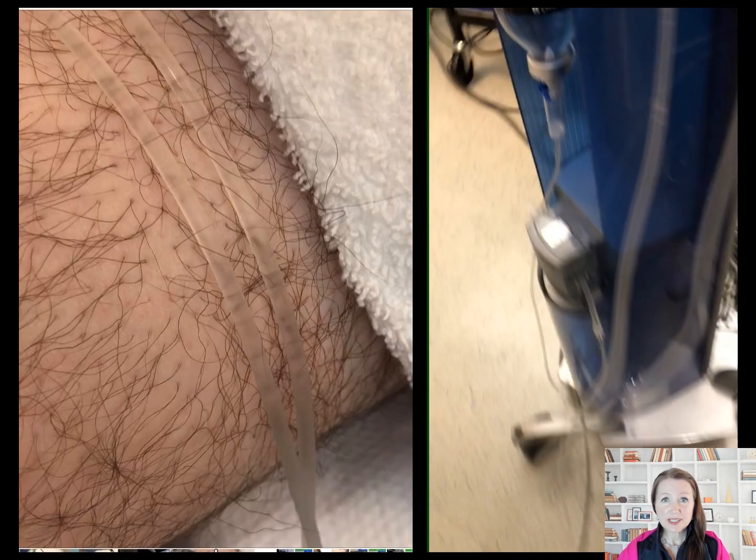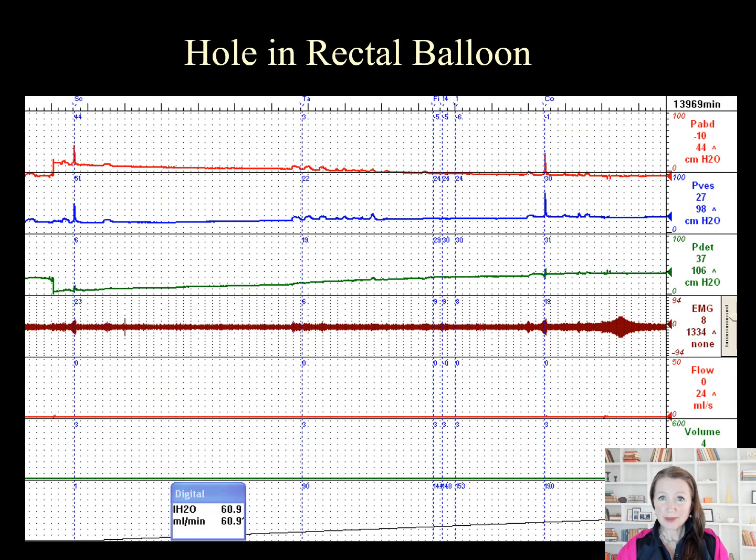We can also investigate the tubing to see if there is any air trapped in the line dampening the pressures. The problem on this tracing is a hole in the rectal balloon. If you don't read it with a critical eye, it will appear that there is poor bladder compliance reflected in the detrusor pressure. However, you can see that the rest of the tracing is responding properly to cough and the P-Vest shows no change in pressure. In this case, the rectal balloon needs to be replaced and the study needs to be repeated.